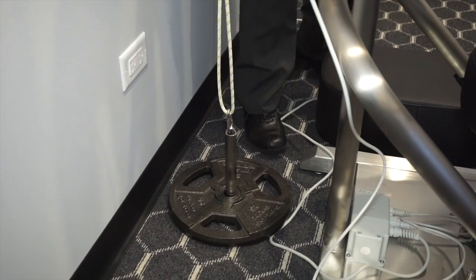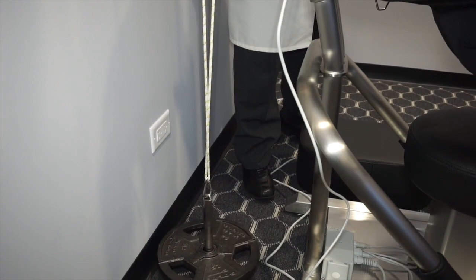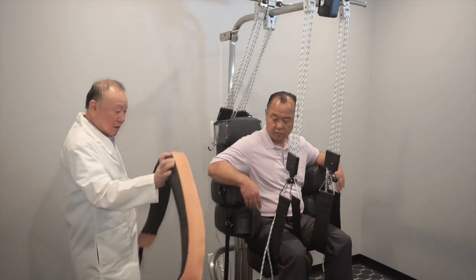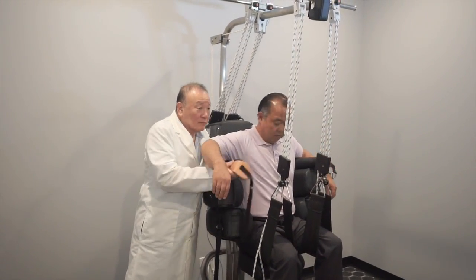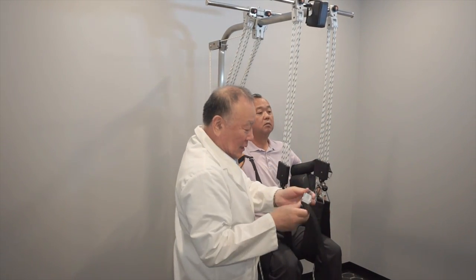The recommended weight is between 10 pounds and 15 pounds, depending on the patient's condition. Additional support for anti-slip. Some patients can be helped by additional support to keep them in place and prevent slipping.